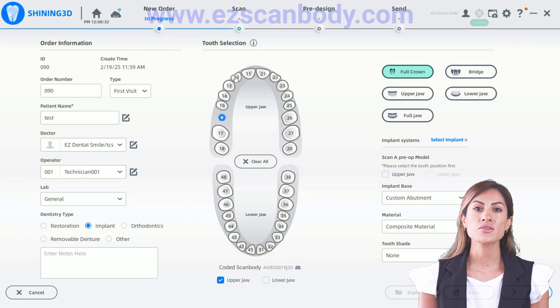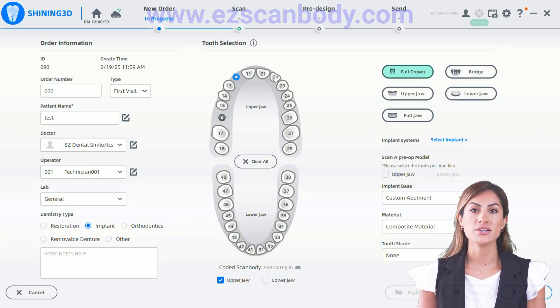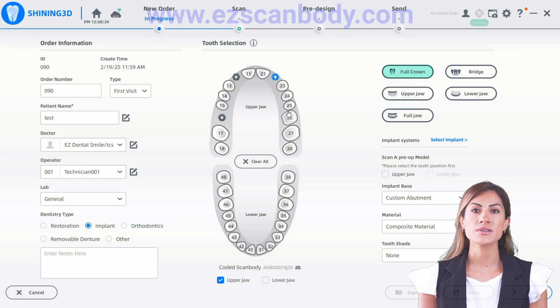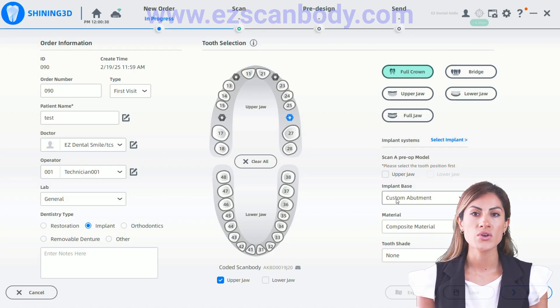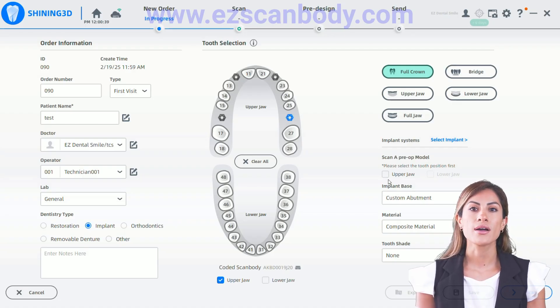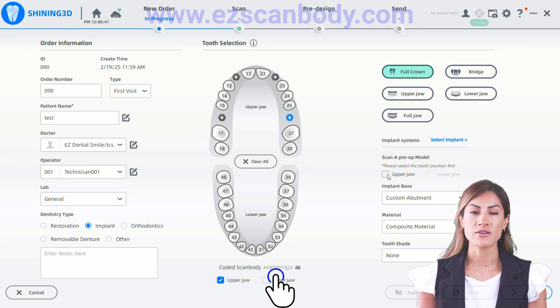To scan the photogrammetry scan bodies, choose the Coded Scan Body option and select the upper or lower jaw you're working on. Ensure that the serial number matches the one on the kit.